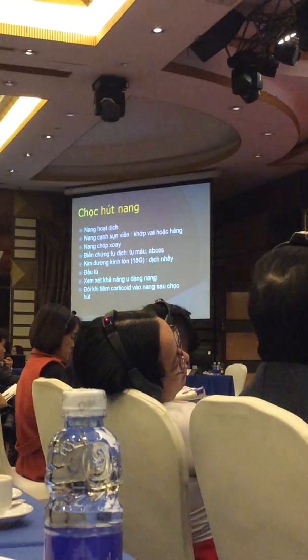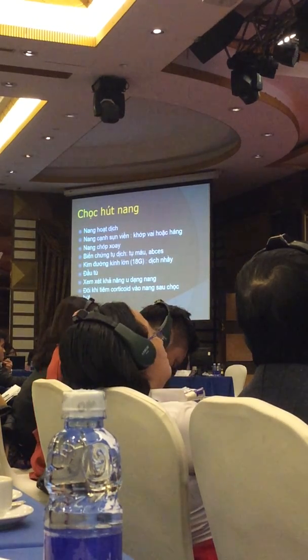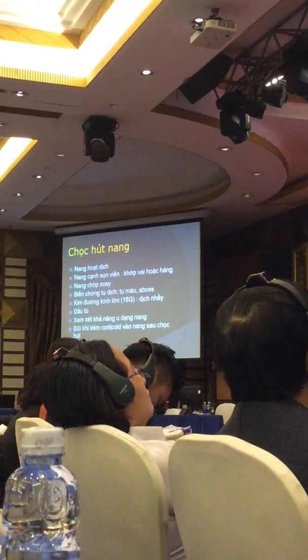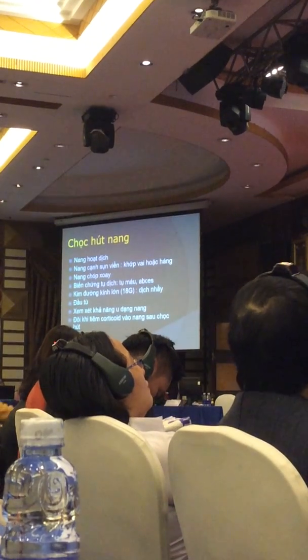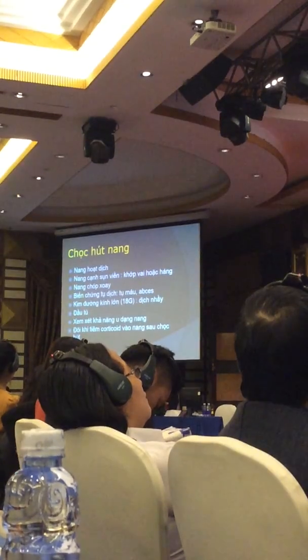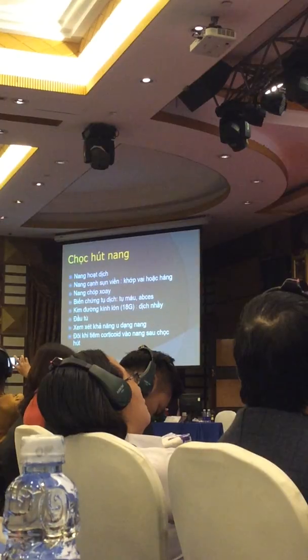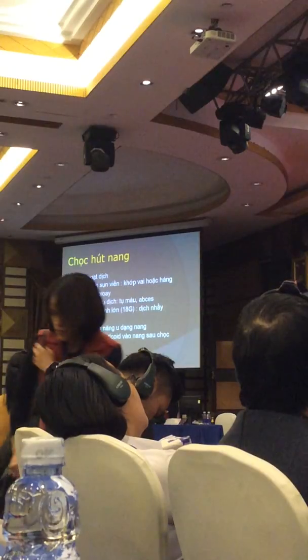For cyst aspiration, we have different indications. You can aspirate a ganglion cyst, a paralabral cyst for shoulder and hip, cuff cysts, complicated fluid collections, which is one of the most common indications for ultrasound-guided cyst aspiration. The fluid collection may be hematoma or abscess, or you may not know and try to determine whether it's a hematoma or abscess. For very viscous, thick fluid, you may want to use a large bore needle, such as an 18 gauge needle.